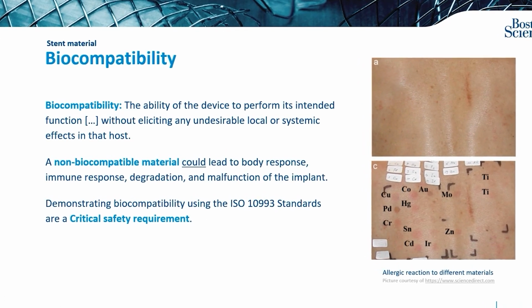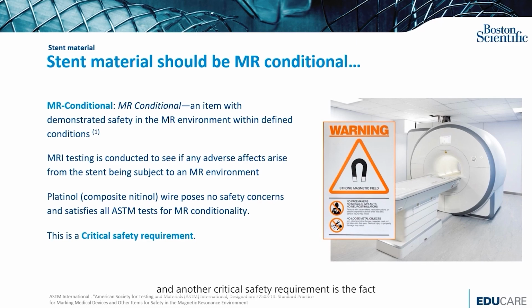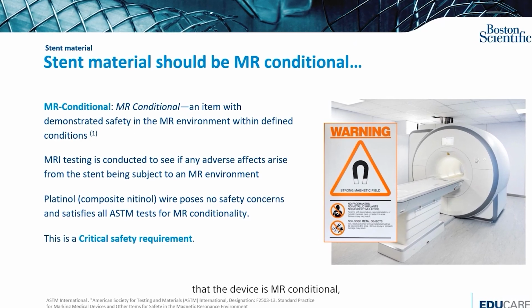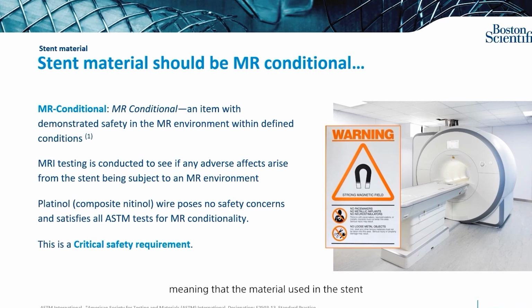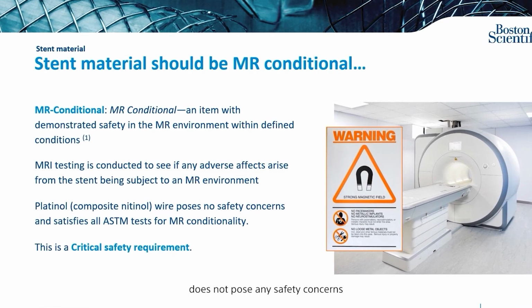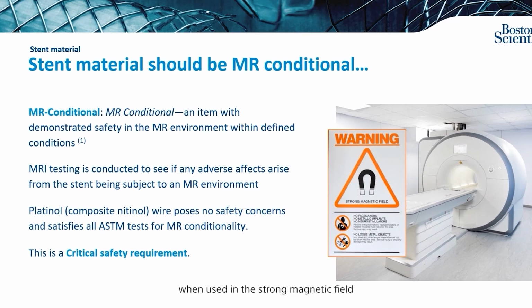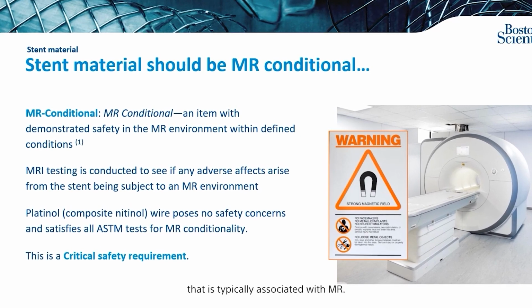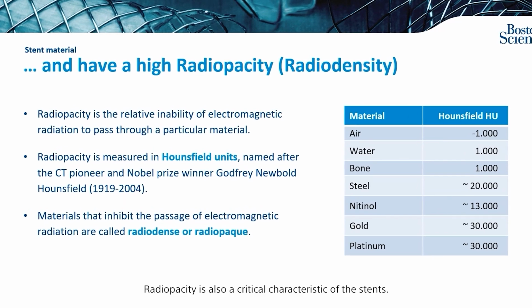Biocompatibility is a critical safety requirement of any implant. And another critical safety requirement is the fact that the device is MR conditional, meaning that the material used in the stent does not pose any safety concerns when used in the strong magnetic fields that are typically associated with MR. Radiopacity is also a critical characteristic of the stents.